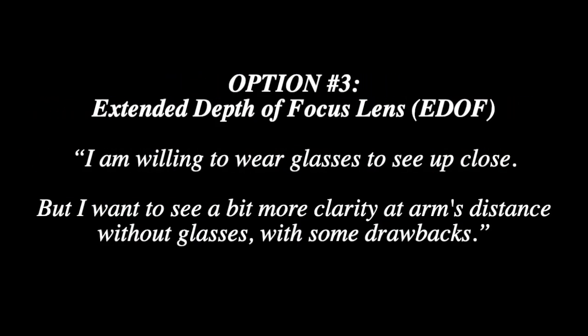This is option 3, the extended depth of focus lens. This is for a patient who says, I am willing to wear glasses to see up close, but I want to have a bit more clarity at arm's distance without glasses, even if it came with some drawbacks.